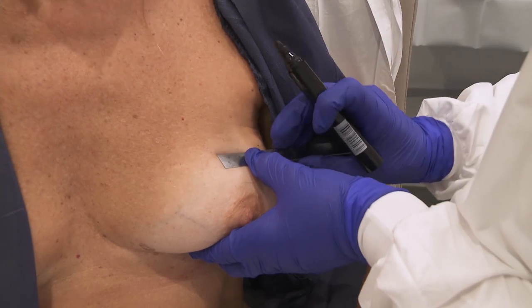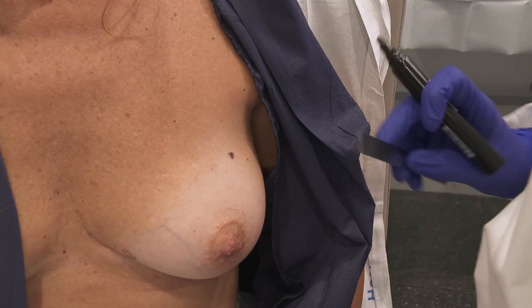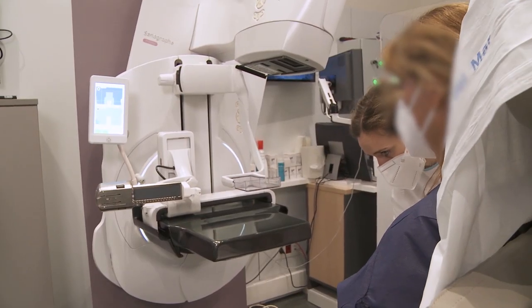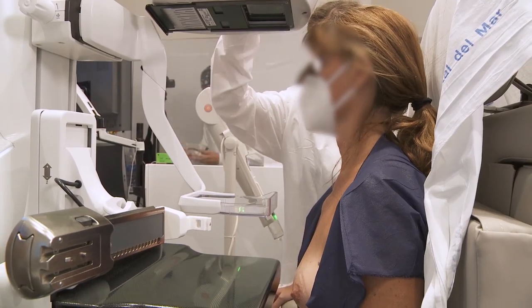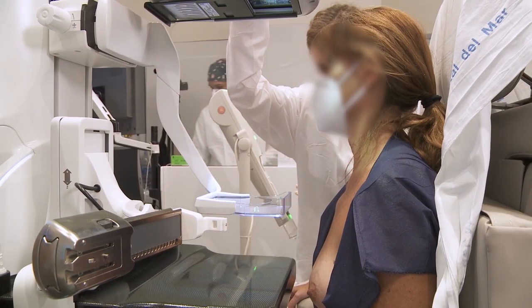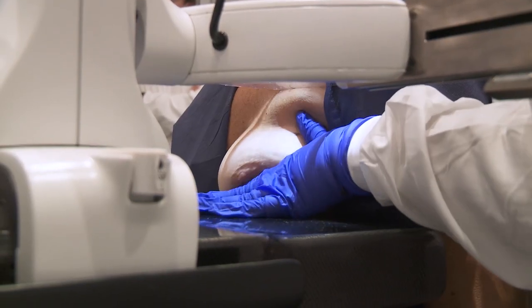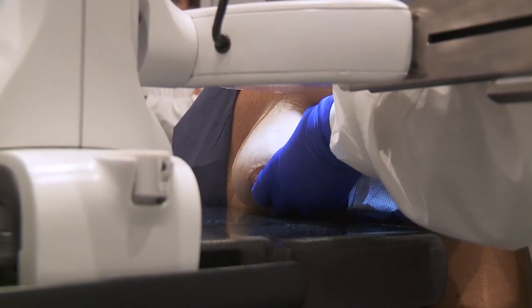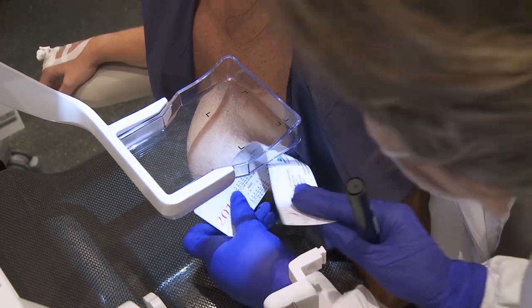Add a skin mark according to the measurements previously done to ease positioning. Since we'll be performing a left side approach, the breast is pre-positioned so that the lesion lies on the left half of the X-ray FOV, which ensures accessibility.